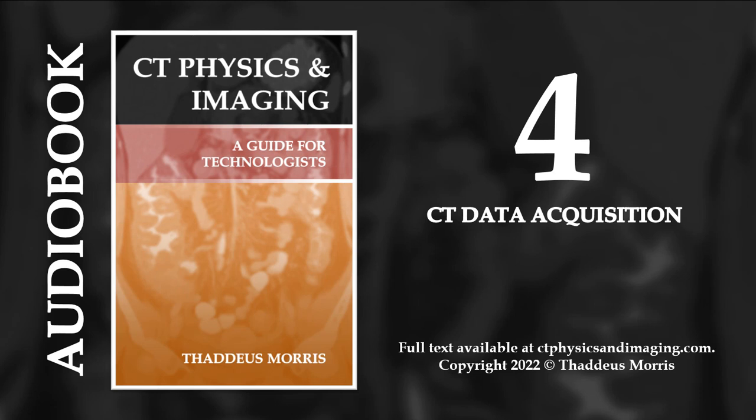All scanning modes create a volume of data, but this scanning mode images the entire organ of interest in just one rotation of the tube. There's no table movement and no additional sections needed. Figure 4.5. Volume mode acquires the entire data set in just one rotation. There is no table movement and no additional sections. This mode requires that the detector array be at least as large as the organs being scanned.